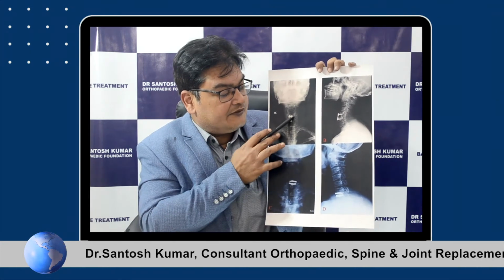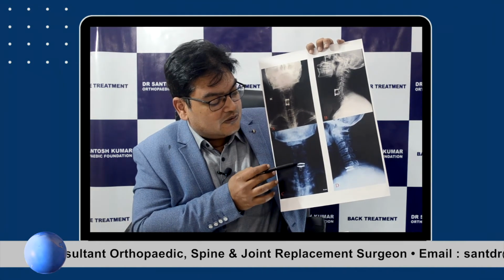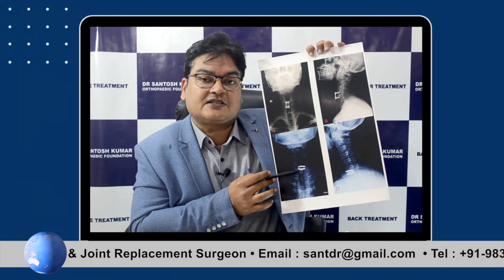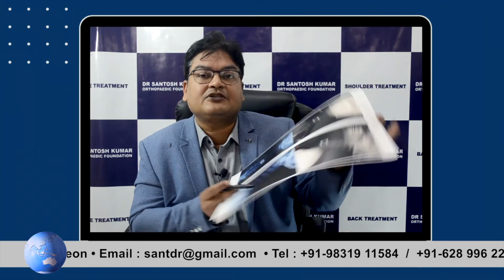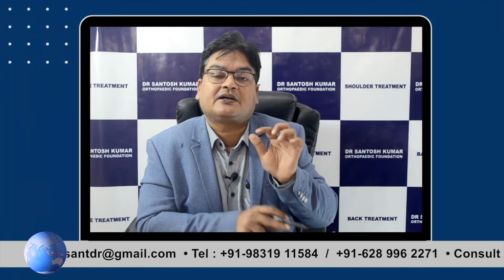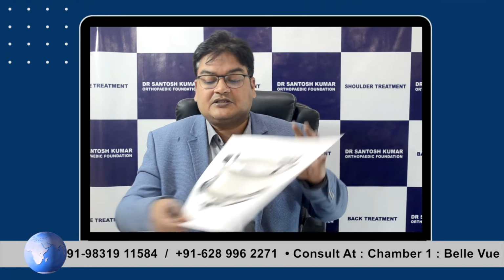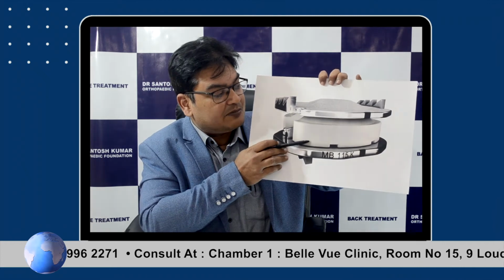And presently, wherever possible, if the criteria are satisfied, we go ahead with replacing the disc with an artificial disc material, which is known as disc arthroplasty. Now the advantage of disc arthroplasty is that it doesn't fuse that particular segment. So it allows movement to take place. That is the advantage. Now this is how a cervical disc arthroplasty looks like.